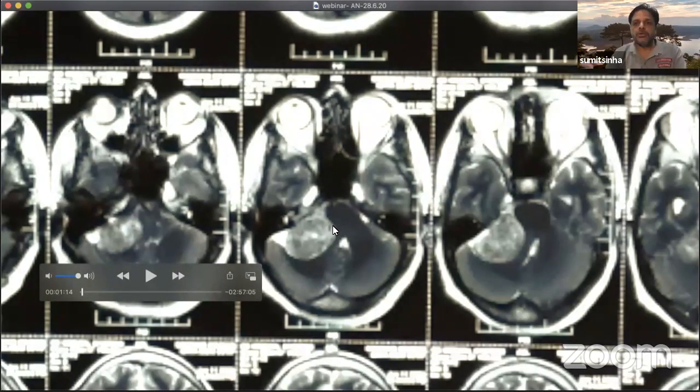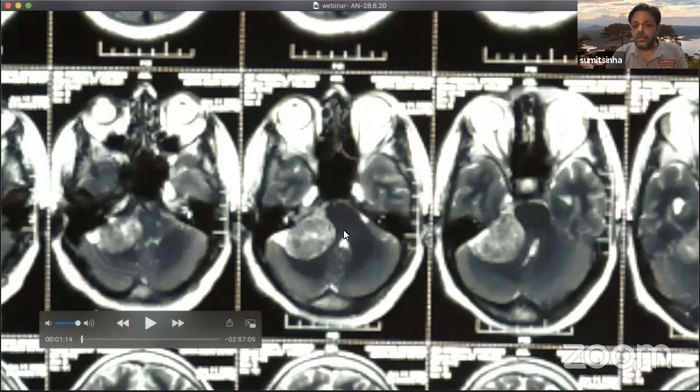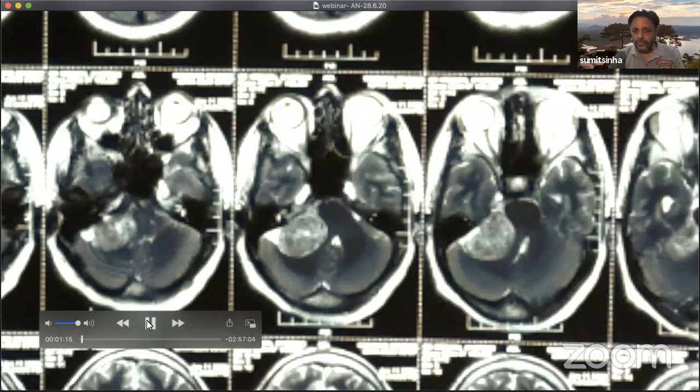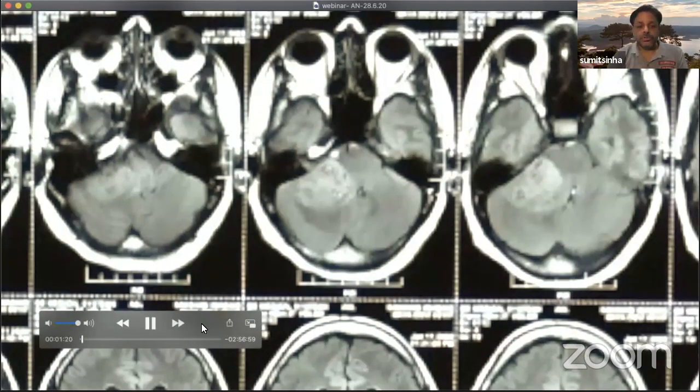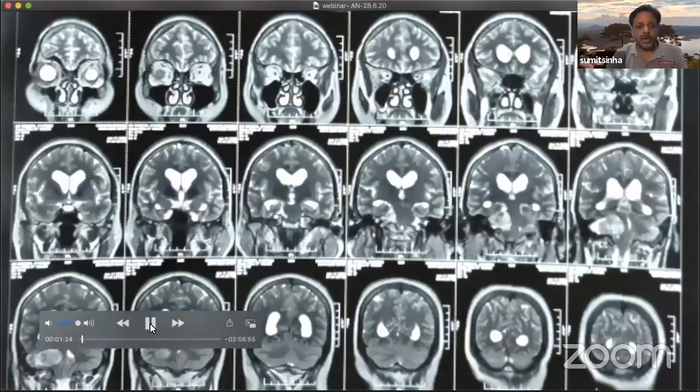The third thing which you have to look for in the MRI is the changes in the adjacent brainstem. Especially in the T2 weighted images, when you see hyperintense areas in the brainstem, this is not a good sign. Even a small amount of handling here could lead to disastrous consequences, hemodynamic complications during the surgery, and later might also create some problems in the post-op period. So this is the information that you have to extract from the preoperative MRI pictures of these patients. You have to study these images in great detail, and they allow you to prepare yourself for the surgery.